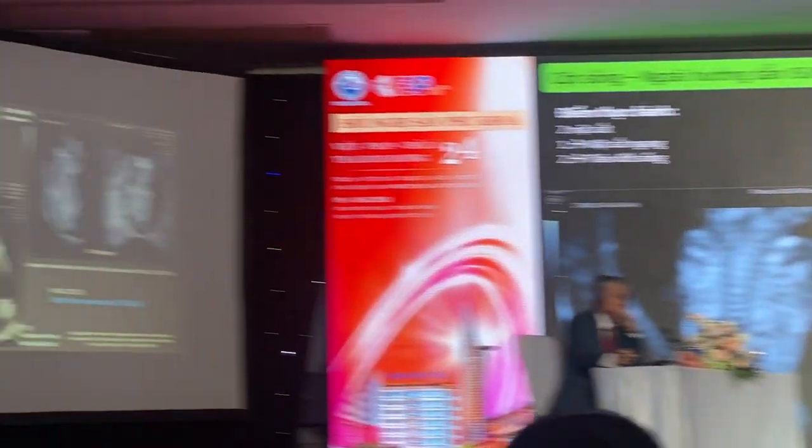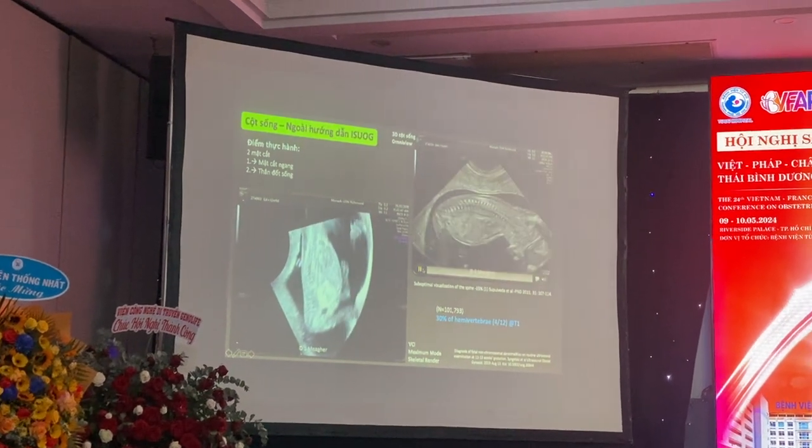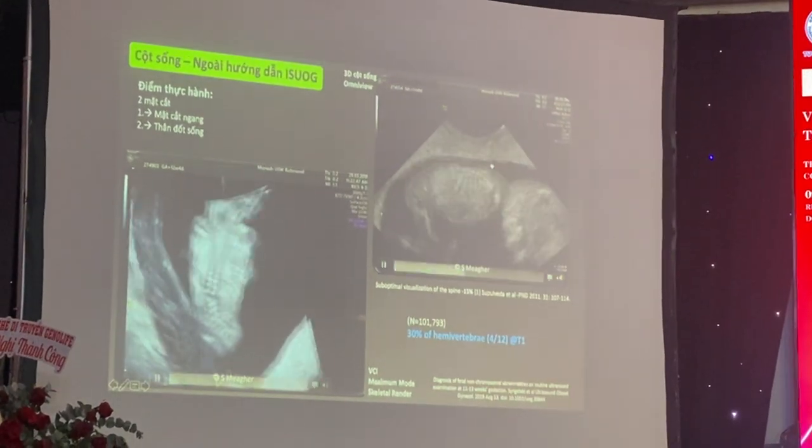Oh, this one here. Okay. Thank you. So if we look at this case here, we run through this baby and we see, as we translate through it, that there's a hemivertebrae.